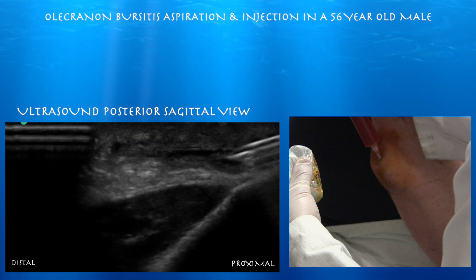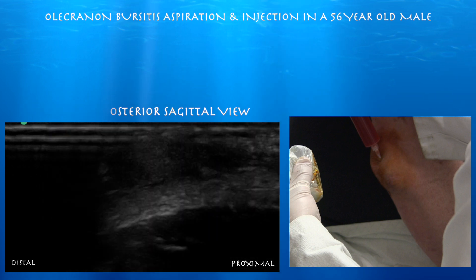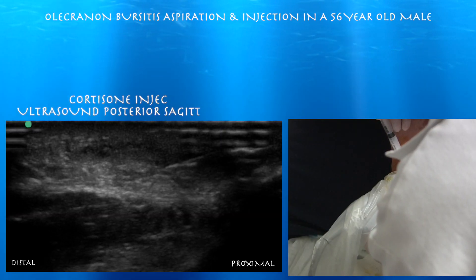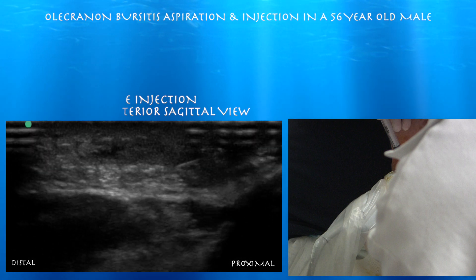Here we are towards the end where everything is just about drained and we're getting ready to do our cortisone injection. There's our cortisone, and we just start to inject it to hopefully prevent the inflammation from coming back.